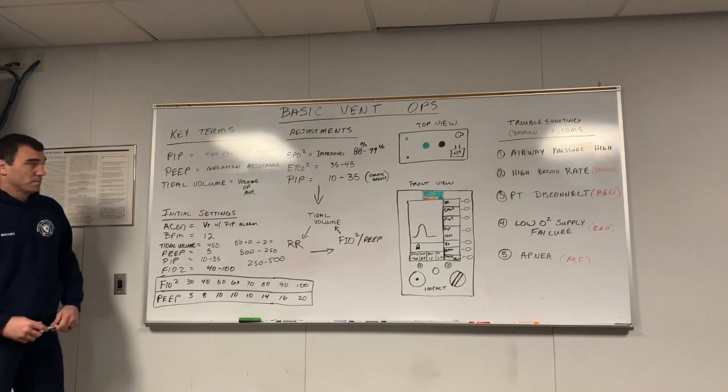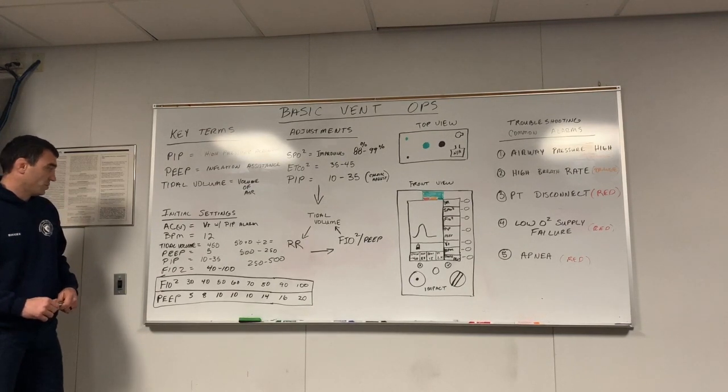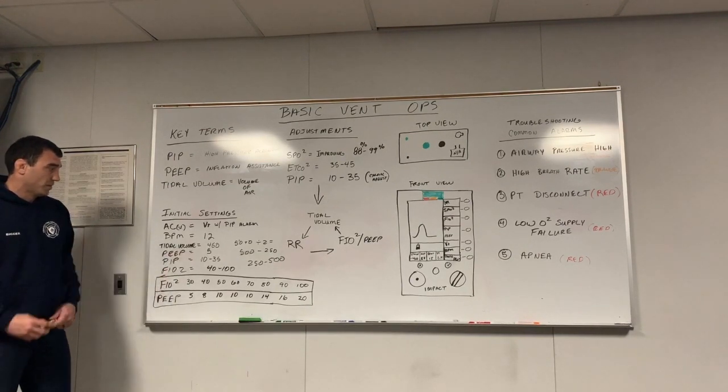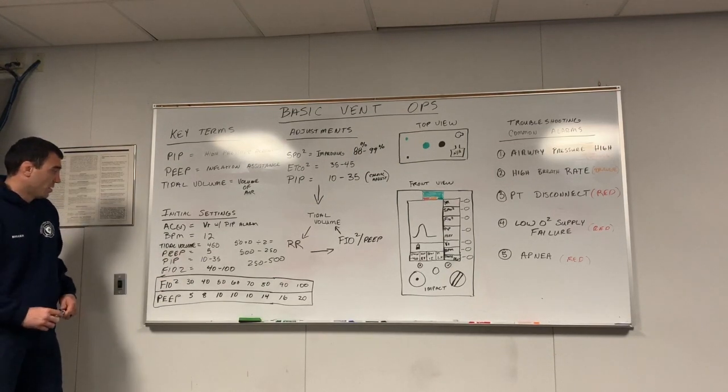Next setting is PEEP, going up our vent. Next one is PEEP. The PEEP will default to 5 whenever you turn to AC mode in our ventilators. That's a pretty decent setting to start with.